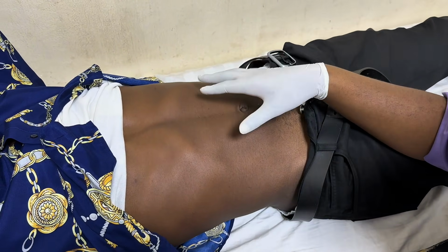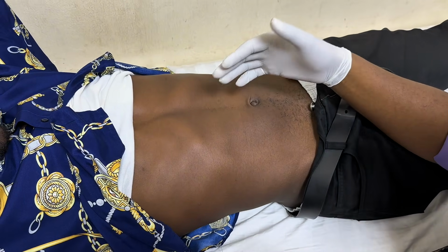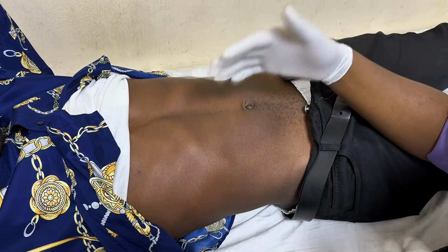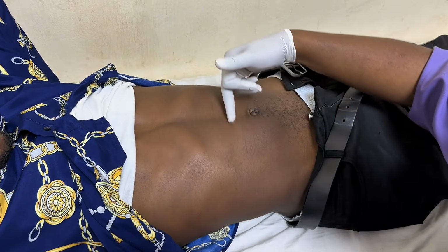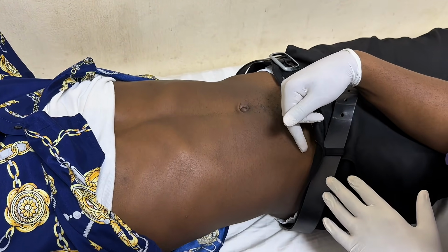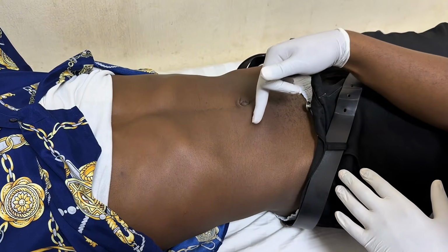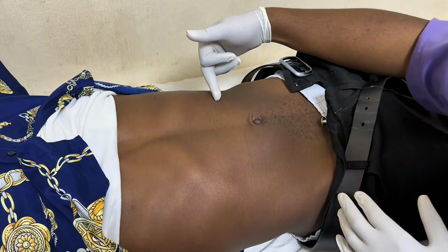But in the human body, it varies in different people. The normal pattern in your textbook is not always like that. You can have the ascending colon coming up like this, and the transverse might come downwards and loop around like this.